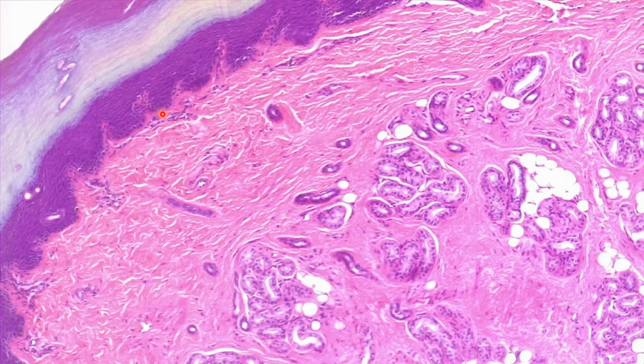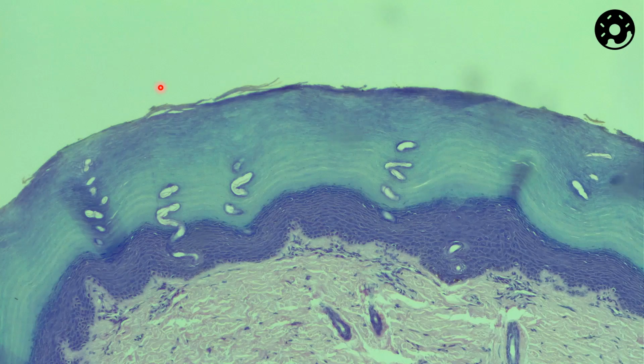Now, another thing I want to show you is look at these layers of the epidermis right here. This, how it looks like these different colors. We're getting to like these pretty mermaid colors. This actually is thick skin. So when we look at thick skin, we can actually start to label some of that strata. Okay, so I want to do that with this last image right here.